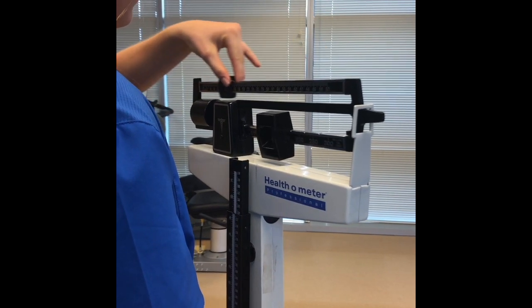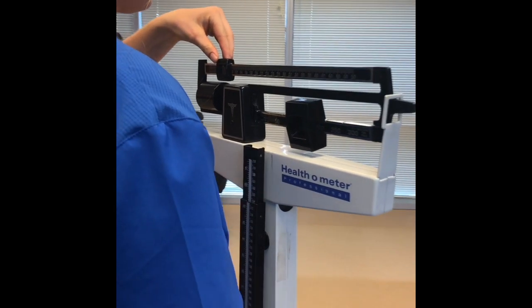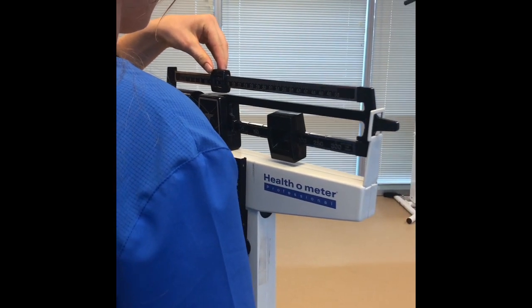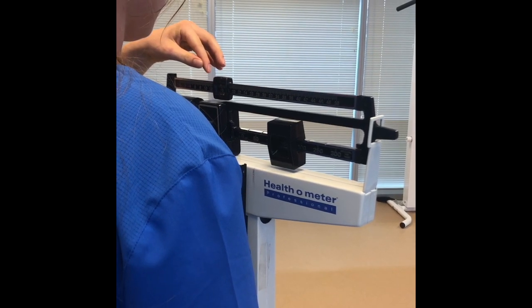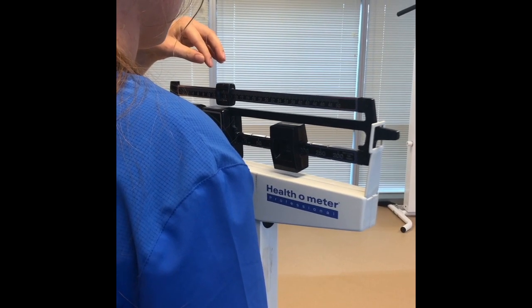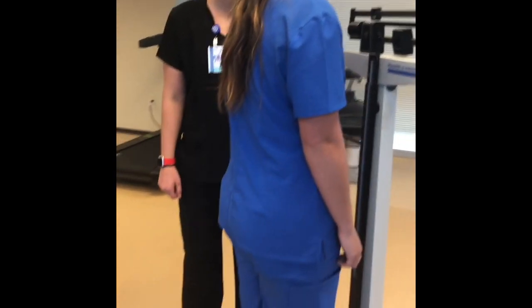So we'll need to go up one more. And you'll slowly move until that piece starts to move a little bit. So she is 166 on the dot. So now you can have your patient step off the scale.